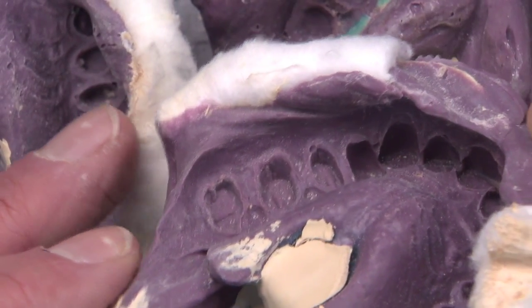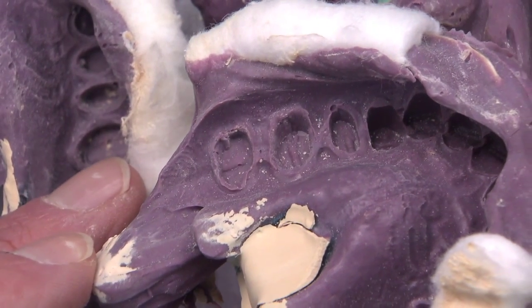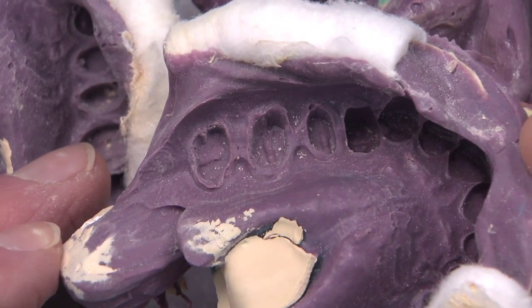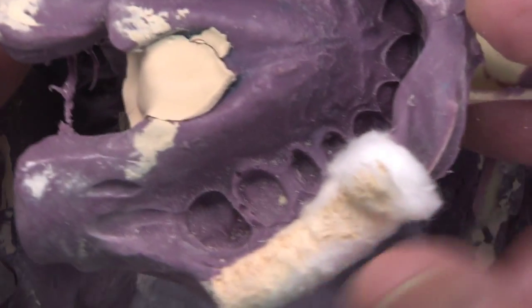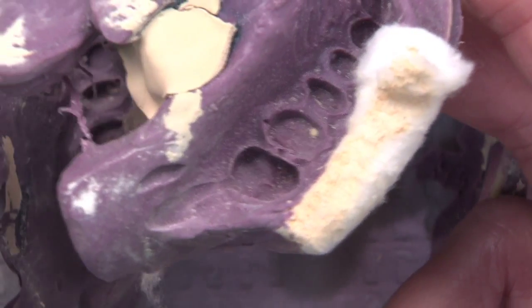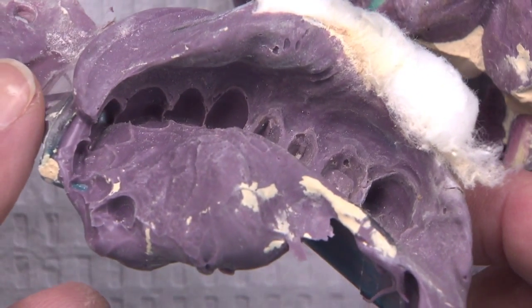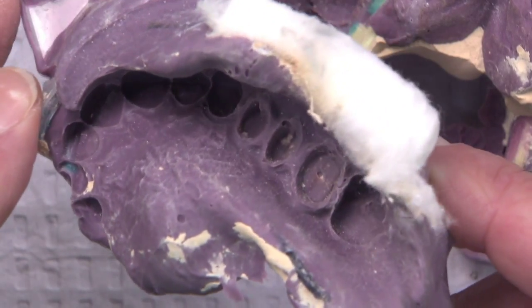I also notice just the one viscosity of material. I don't think that's that big of a deal if you pack cord. I use that 2-cord technique, and frankly, I think I could get decent results with just heavy body with that 2-cord technique, because you have a huge sulcus that you could drop your car keys into. And again, that's not skill on my part. If anything, it's discipline. It's the discipline of doing the 2-cord technique, and it's letting my assistant hop in and do some of the cord packing, which she's allowed to do in California. But when you have a sulcus that open and that wide, there's no doubt you're going to be able to get any impression material in there.